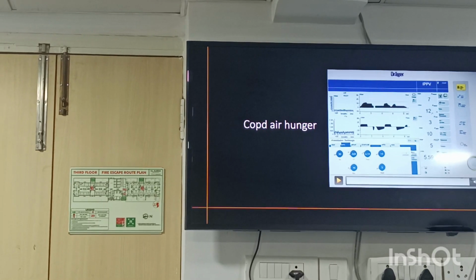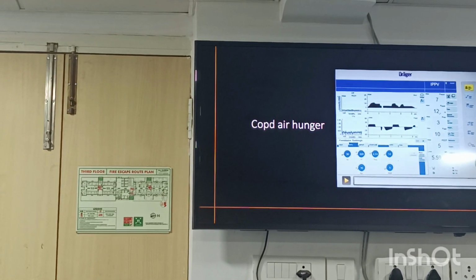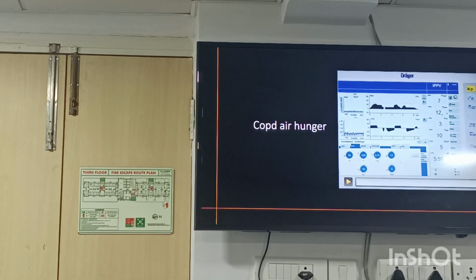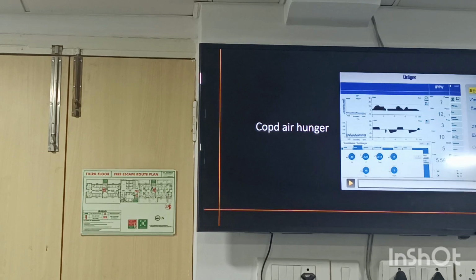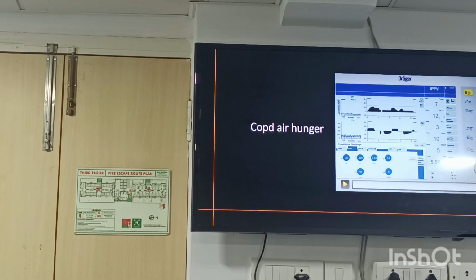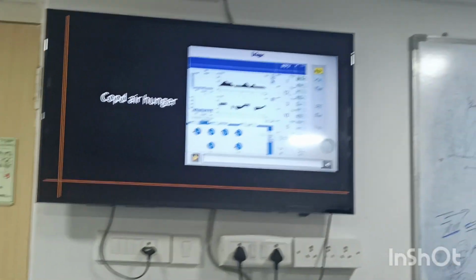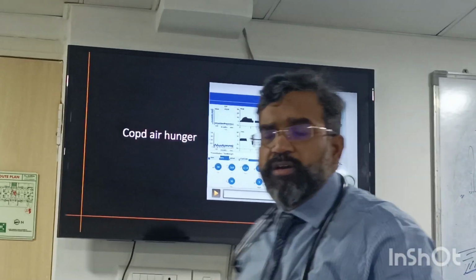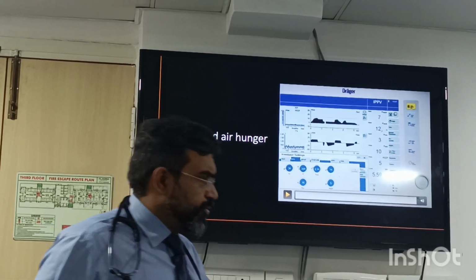So when you have a COPD patient and you have pressure, volume and flow, flow is constant in IPPV. The patient is taking more. He wants more. Is he getting more flow? Because it is constant. What is changing? Pressure. And that's what you have to find out when you're looking at your pressure, flow and time waveforms. Clear on this? Want to see this once more?